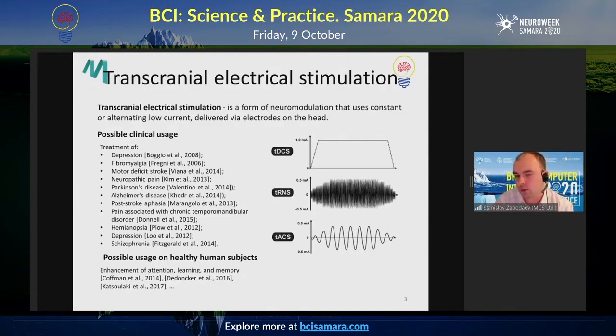It's like noise stimulation. For example, if you go from 0 to 300 hertz, in this band, you see no effect, but when we stimulate from 400 and up, you see some effects that we didn't see in the past.